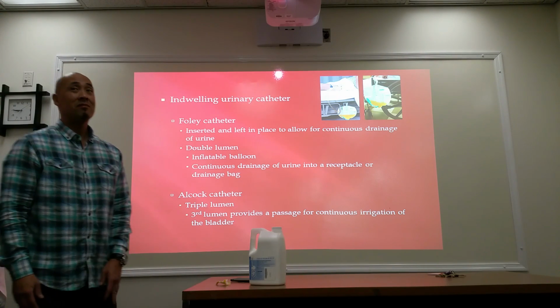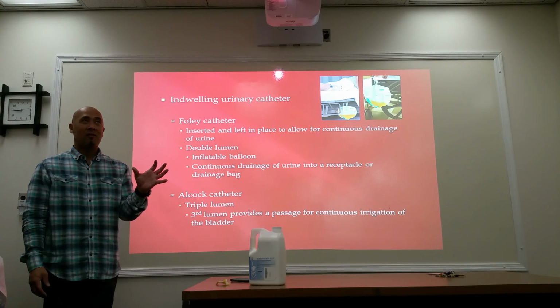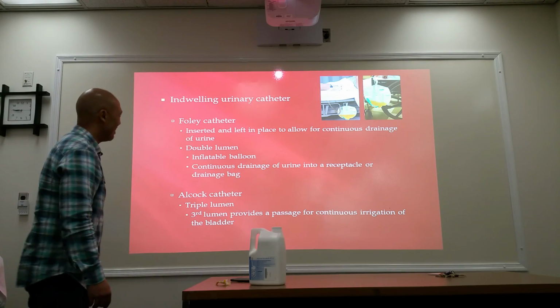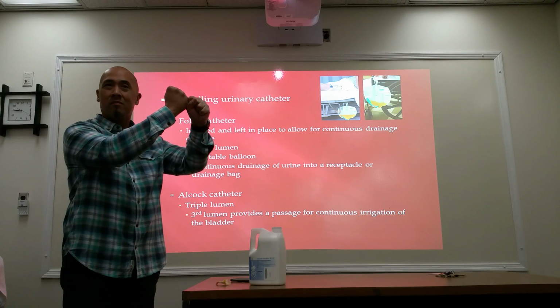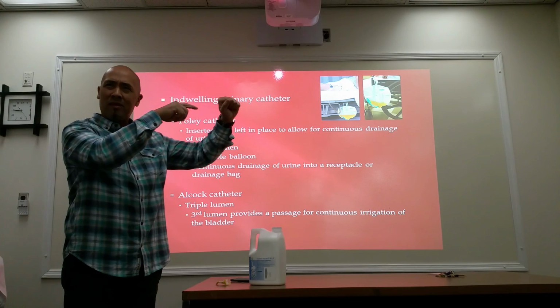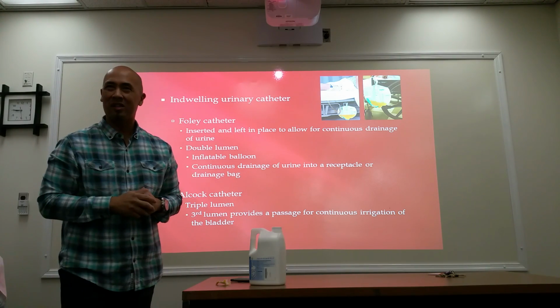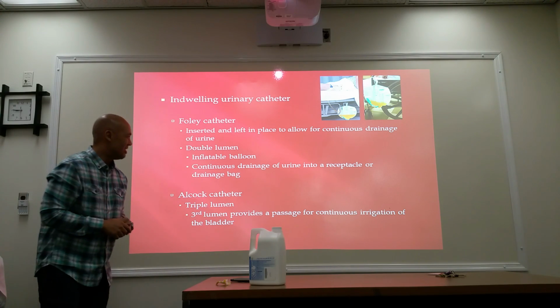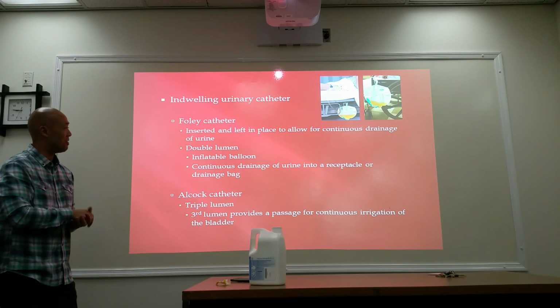It hurts. You hear, oh! Oh, crap. Okay. Remember, it's a rubber balloon, so it's very pliable. Okay? So even after it gets pulled out of the bladder into the urethra, it's still pliable. So it hurts a little bit. I should say, I don't know, it never happened to me, so it probably hurts a lot.